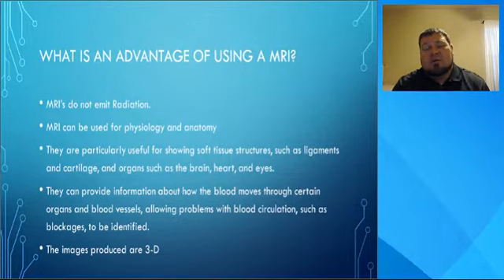One of the things I can't stress enough is always, if you have a scan that you need to have done in MRI, always make sure you let the MRI techs know if you have a pacemaker or if you have any metal on you, always take it off. And it doesn't even hurt to second guess. I've been doing this for quite a while now, and there's not one time where I walk into a magnet room that I'm not checking my pockets and making sure I put away my wallet, phone, keys, all that, because it's just a measure of safety for you as a patient and for the people that are scanning you.